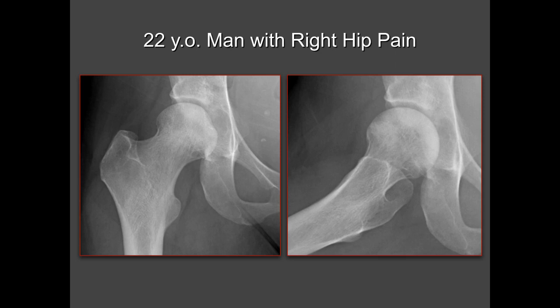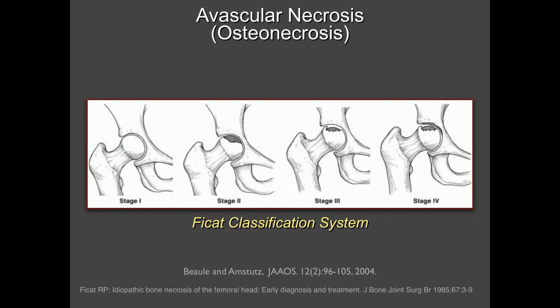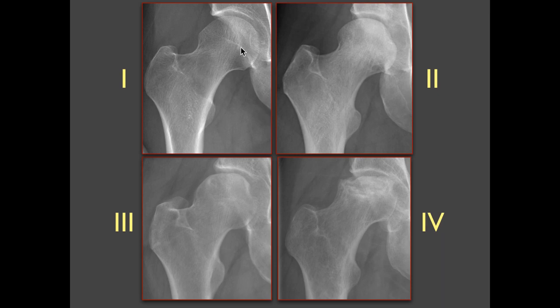Here's a 22-year-old man with gradual onset of right hip pain. You may notice increased density and sclerosis in the femoral head, visible on the frog leg lateral view as well. The joint space looks normal, and the contours of the femoral head look pretty normal. This is actually avascular necrosis in a patient with sickle cell anemia. This is staged according to the FICAT classification, stages 1 through 4. Stage 1 is basically completely normal radiographs; stage 2 is sclerosis with maintained contour; stage 3 is where you start to get flattening of the femoral head; and stage 4 is further flattening typically with joint space loss.